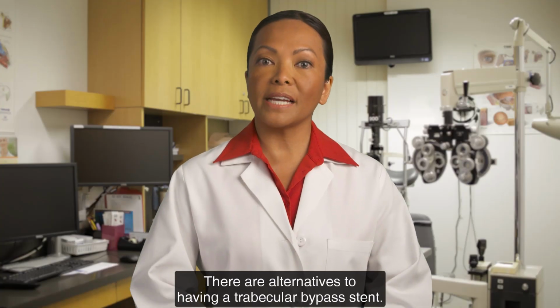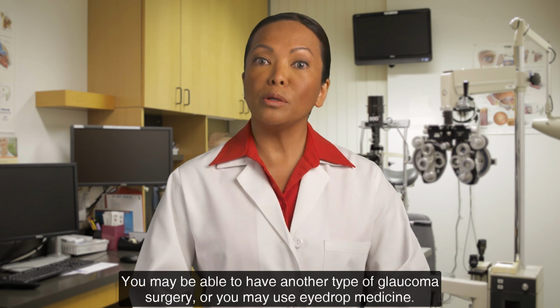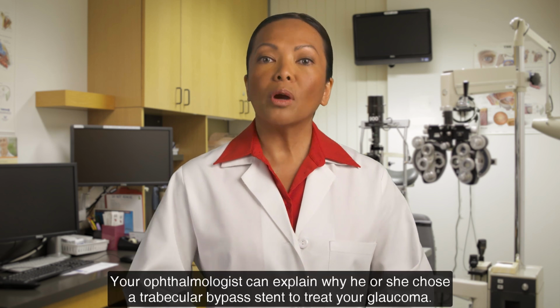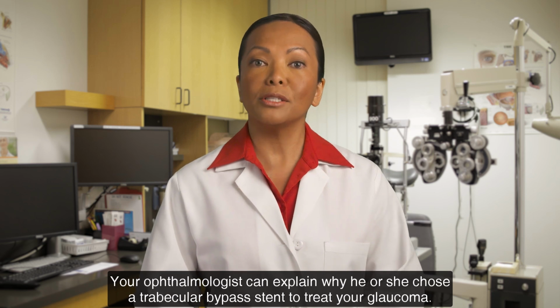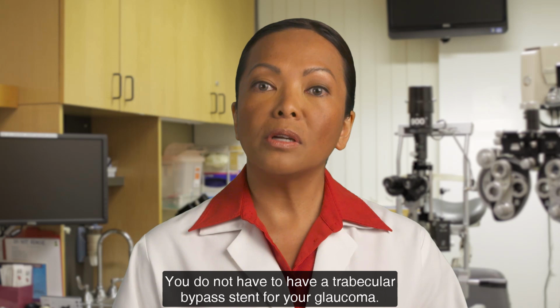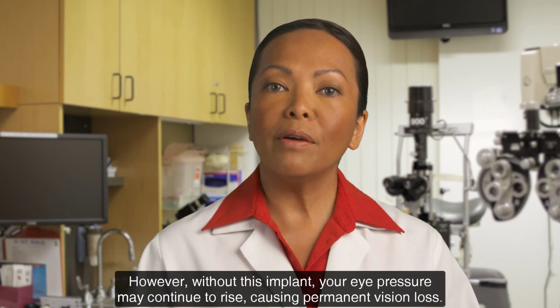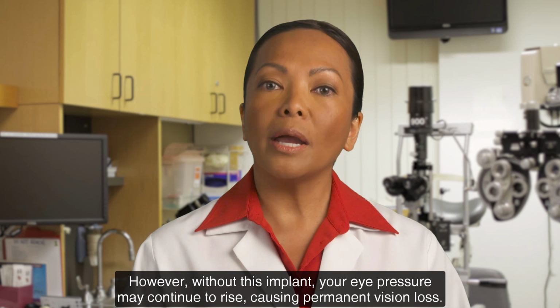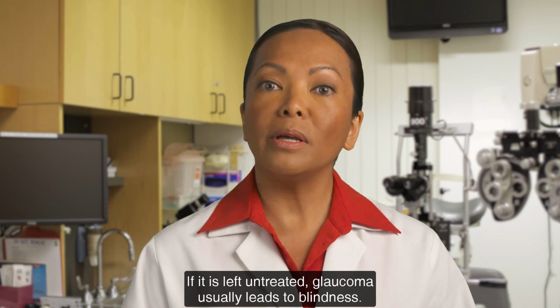There are alternatives to having a trabecular bypass stent. You may be able to have another type of glaucoma surgery, or you may use eye drop medicine. Your ophthalmologist can explain why he or she chose a trabecular bypass stent to treat your glaucoma. You do not have to have a trabecular bypass stent for your glaucoma. However, without this implant, your eye pressure may continue to rise, causing permanent vision loss. If it is left untreated, glaucoma usually leads to blindness.